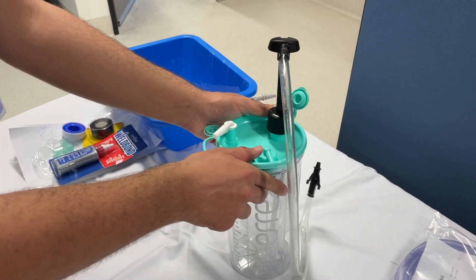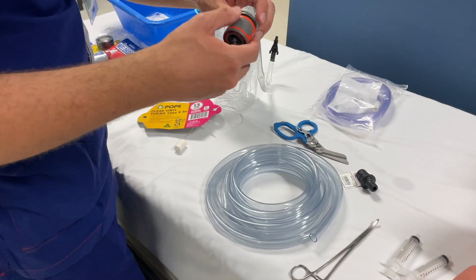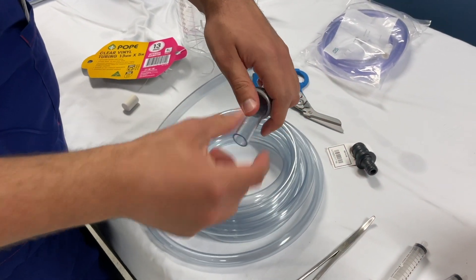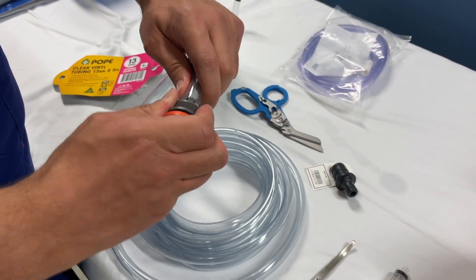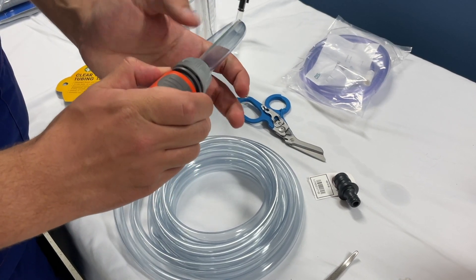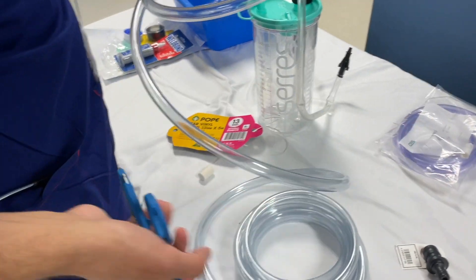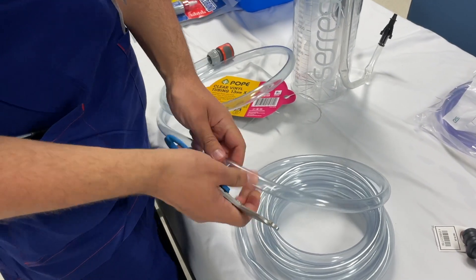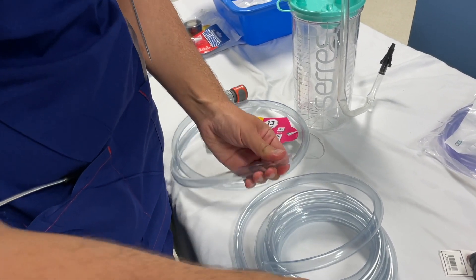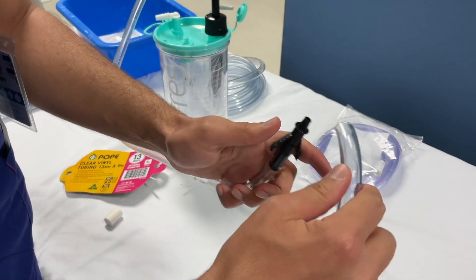We take a 13 mm tubing and use our Gardena connector. We connect it to our tube. And we take our Laderman Raptor and cut it to the right length — just a bit more than a meter.